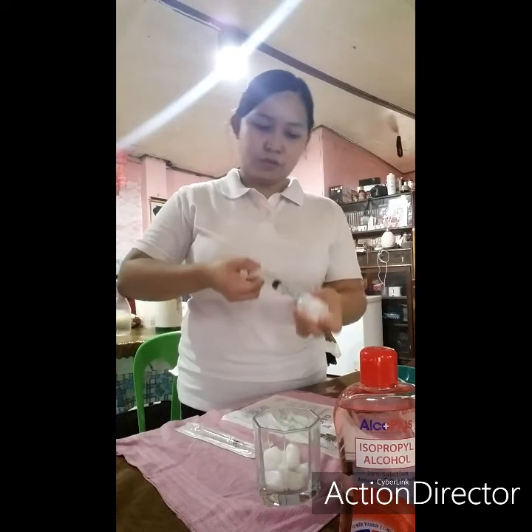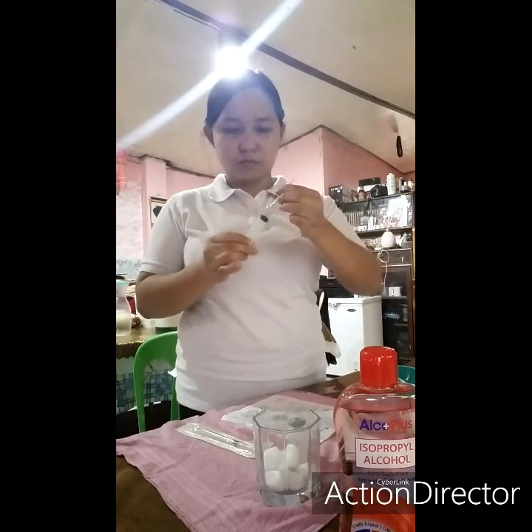Then check for any air inside. Then close and change it to its original needle. Then put it in the kidney basin.